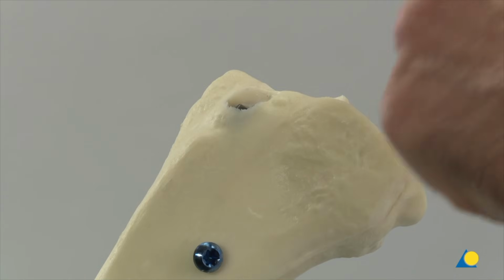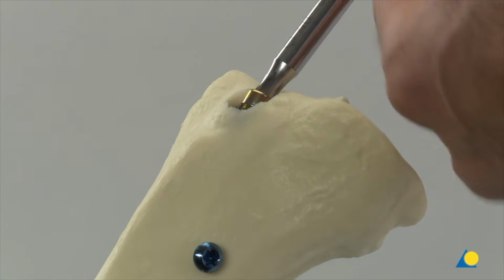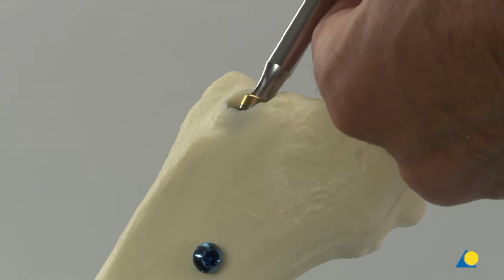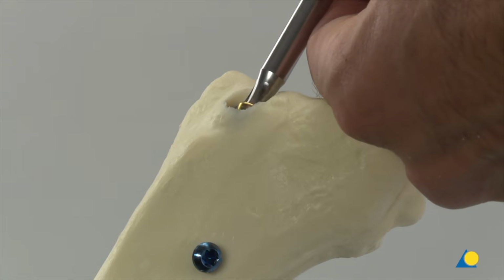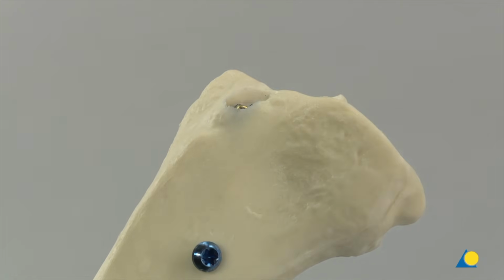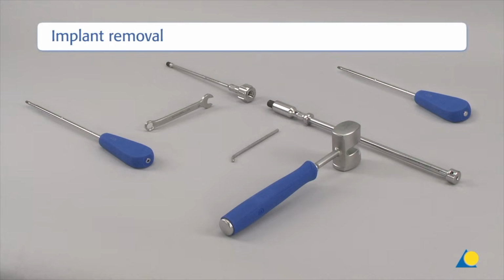To prevent cross-threading, the end cap is inserted in line with the nail axis. A counterclockwise turn can be used to thread it in the nail before clockwise turns are used to advance it and secure it. Clinically, implant removal is an optional procedure.